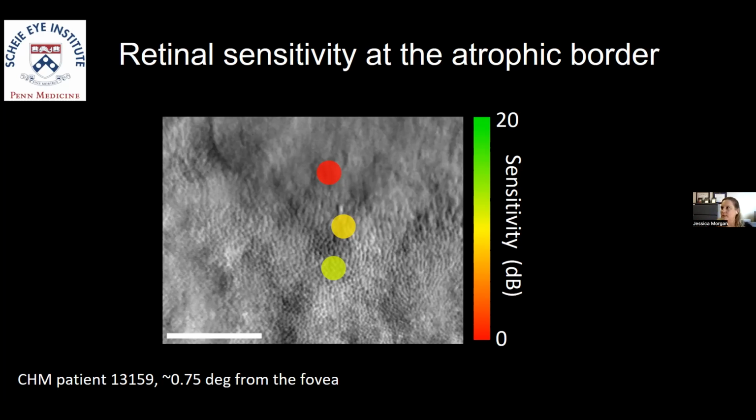I think our percentage was around 75%. I'd have to go back and look at the exact paper methods, but that's on the order of what it was. So like 75% threshold seeing. So you do this stepped QUEST staircase to get there. I think we used 20 trials per staircase and ran each location at least 3 times.